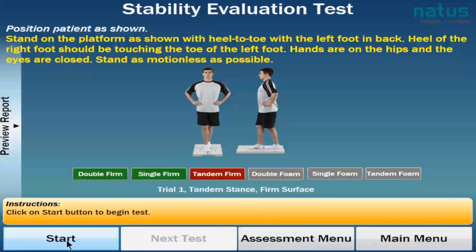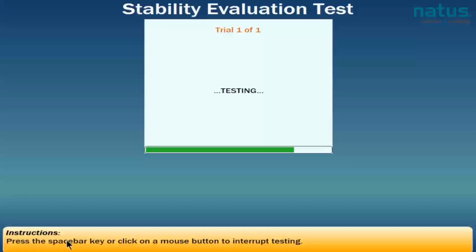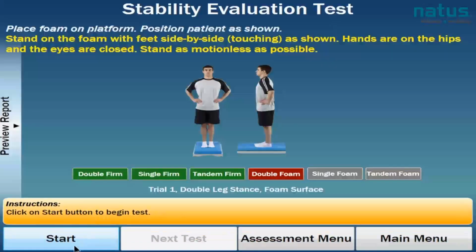Tandem stance, eyes closed. Great. And we're starting. And he's much more stable in this position. Over halfway there. Doing great. And open your eyes. Good work. Go ahead and relax. And now I'm going on to the next trial, which is going to be with the foam Airex pad.